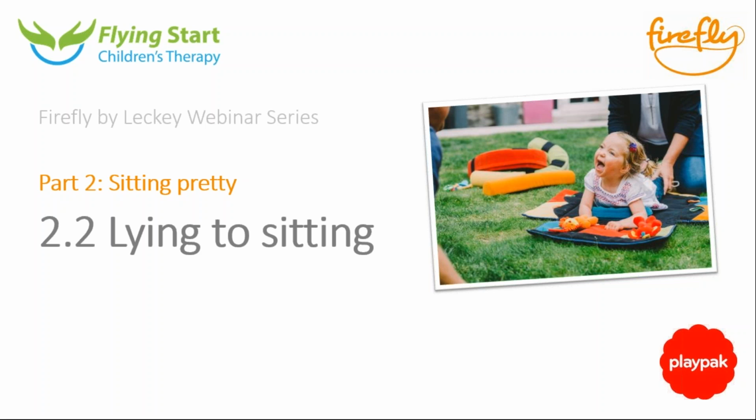And that would, because his shoulders are there, hopefully limit a little bit of his overextension, his thrusting backwards. You can then help as well to take his hands forwards and play with his hands in front of him. And you say he fists his hands, so take his thumb out first, which will hopefully loosen up his fingers. So get your hand within his and take the base of his thumb out, so you're not pulling it from the top of the thumb, but from the base of the thumb, and that may help loosen out the fingers. And then just gently put them on the floor.